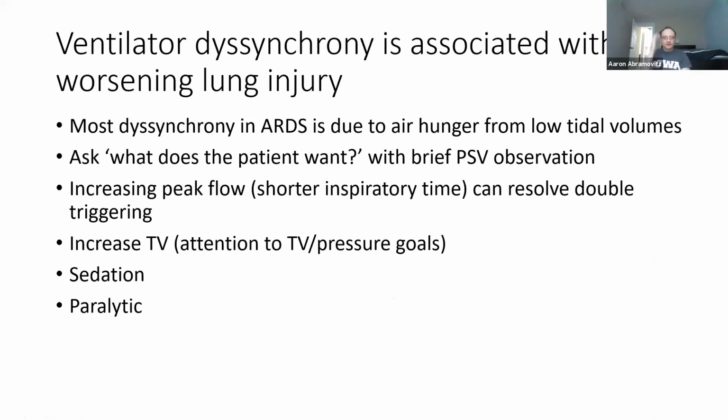And finally, ventilator dysynchrony that we talked about earlier. In ARDS, most of it is due to air hunger from the low tidal volumes. Very uncomfortable to be forced to breathe 30 times a minute, shallow. If there's a lot of dysynchrony, you can always increase sedation, which we do.